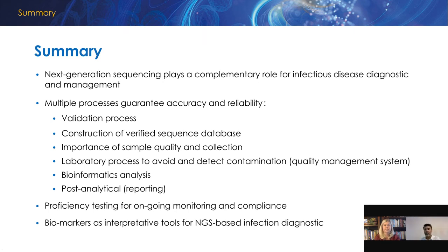The other opportunity is some agreement or alliance with a company that can provide the data analysis based on a cloud-based platform. So the hospital has all the setup working with this company, the data can be submitted to a cloud and the cloud can send back the result, because the analysis is performed in the cloud with these companies. They actually have curated, reviewed, and very well-kept databases for the analysis that is done in the local hospital.